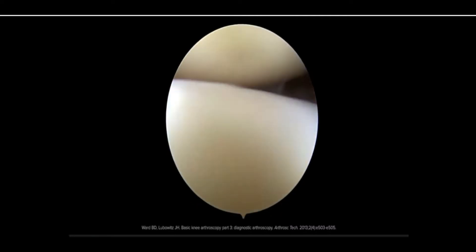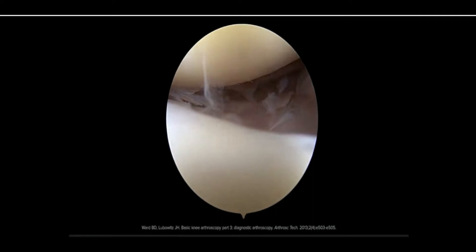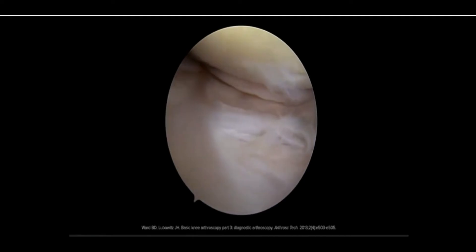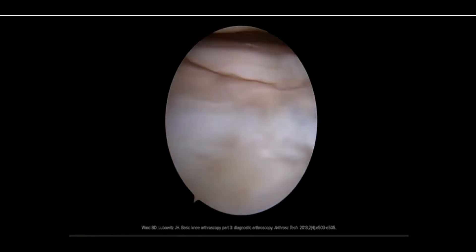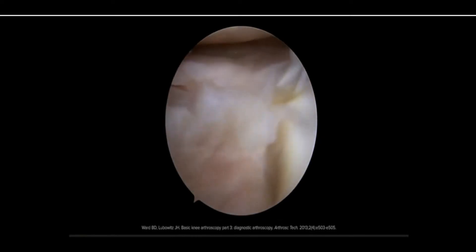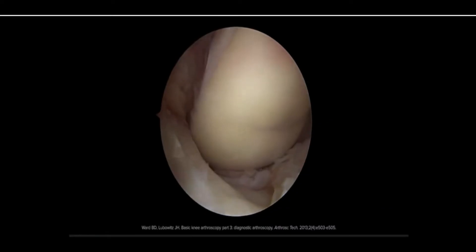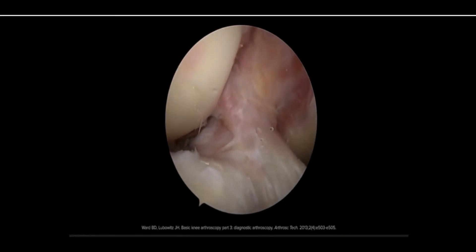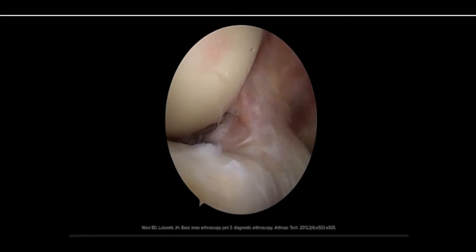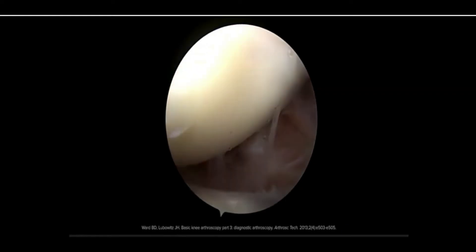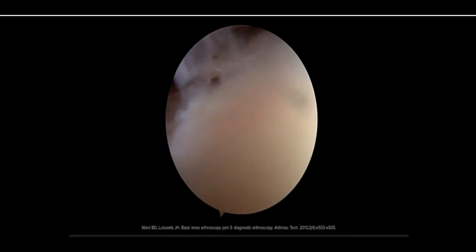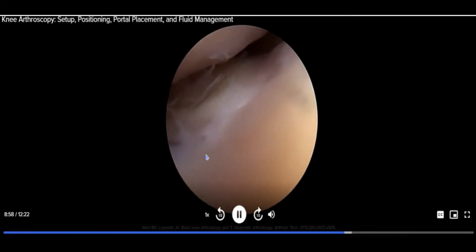Move the scope to the medial compartment for a formal evaluation of the medial meniscus and the articular surfaces of the femur and tibia, as well as the inferior portion of the trochlea. Place gentle valgus stress on the knee to help open the compartment and improve visualization. As the scope passes through the intercondylar notch, the anterior and posterior cruciate ligaments can be visualized and evaluated for integrity. If anatomy allows, visualization of the posterior roots of the meniscus should be obtained, though this can occasionally be challenging with a standard arthroscope due to the caliber of the sheath and angulation of the view.